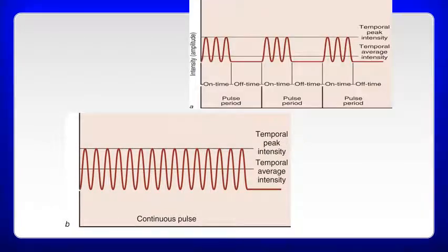So again, this looks at duty cycle. When you're going to do an ultrasound treatment, one of the things you're going to determine is, are you trying to get a 1 degree increase or more in the tissue temperature, or are you looking to not get a significant thermal effect? Again, you say non-thermal, technically there will always be some type of thermal effect, but basically you're keeping it below. If you're keeping your thermal increase below 1 degree, it's not significant. It's not going to impact what goes on with the tissue. Everything 1 degree Celsius and above will.